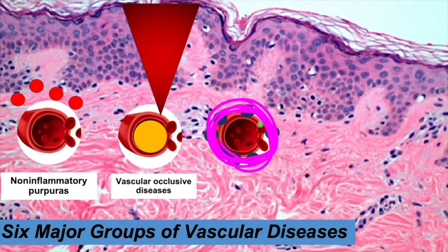You will see here lymphocytes, neutrophils, inflammatory cells basically, and you will see fibrinoid necrosis. Sometimes you don't see fibrinoid necrosis because the lesion is early and has not developed the necrosis, or probably the biopsy has not gotten that vessel that has the fibrinoid necrosis. So you have to depend on other clues to help you make the diagnosis.